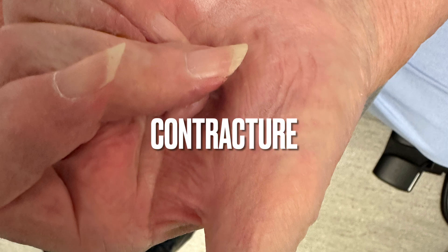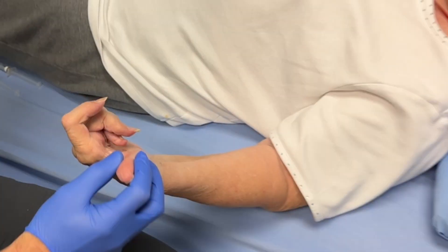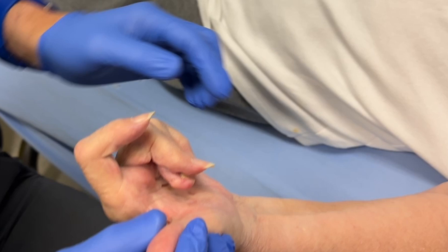A contracture after a humeral fracture with radial nerve damage, referred by plastic surgery. We are going to do a median and ulnar nerve block because of the maceration. There's a lot of bad odors coming from that hand and likely a lot of skin breakdown. There's no active or passive movement possible.